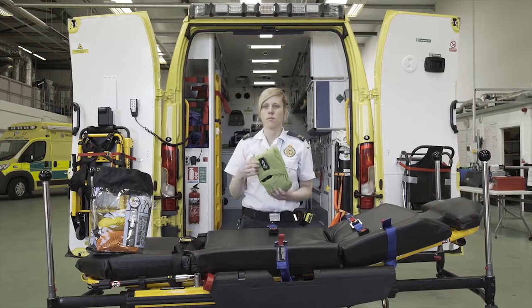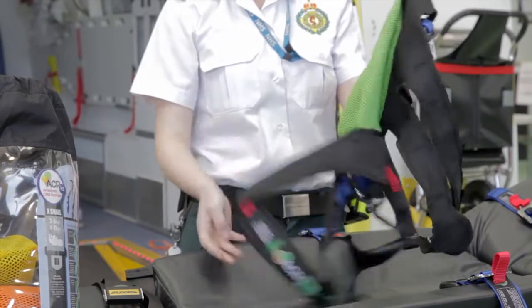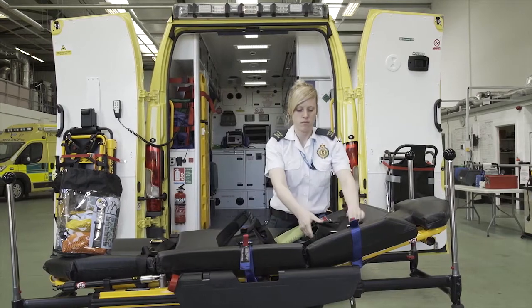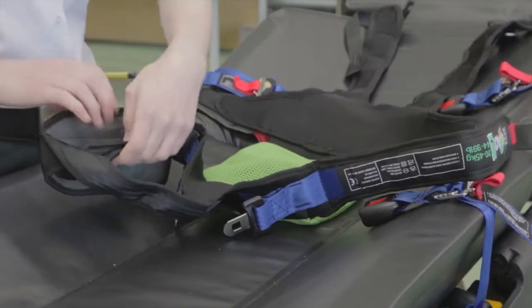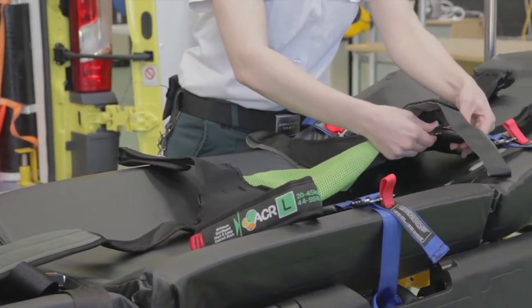Open the ACR with the label facing away from you. Open so the restraint is fully exposed and ensure the chest strap buckle is unclipped. Now lay the ACR on the mattress with the bed mount strap buckles facing down and the crotch strap pointing towards the bottom of the cot.